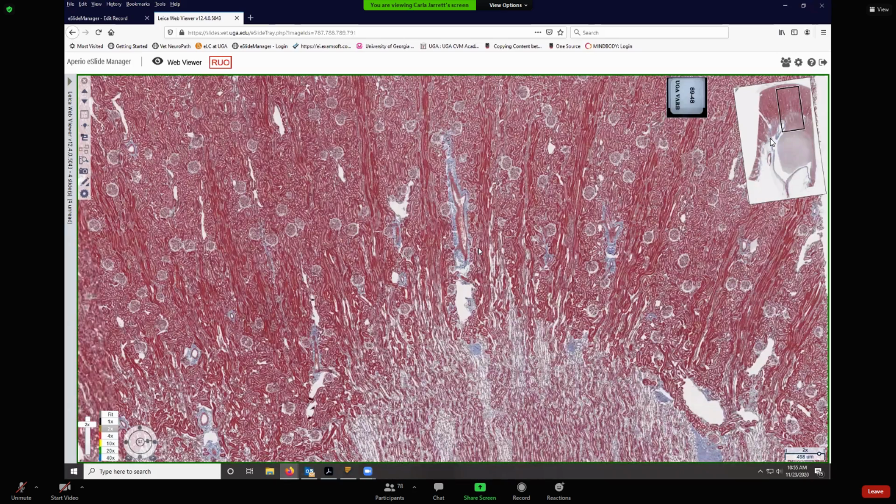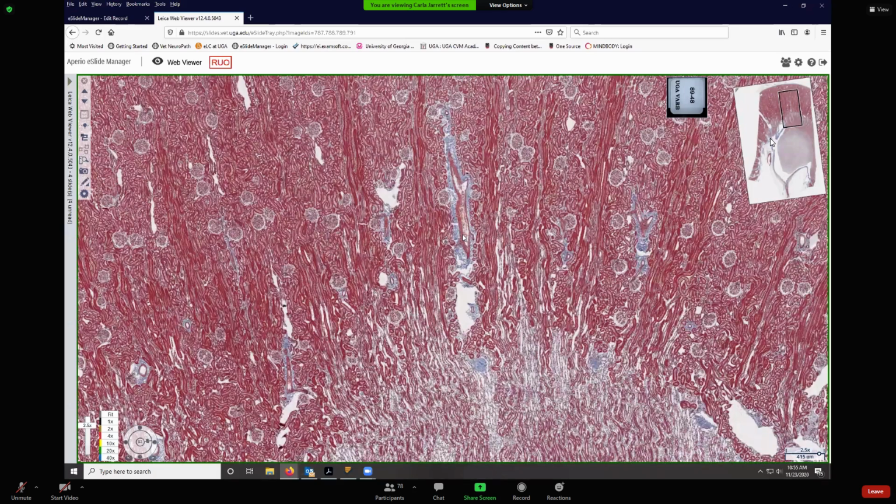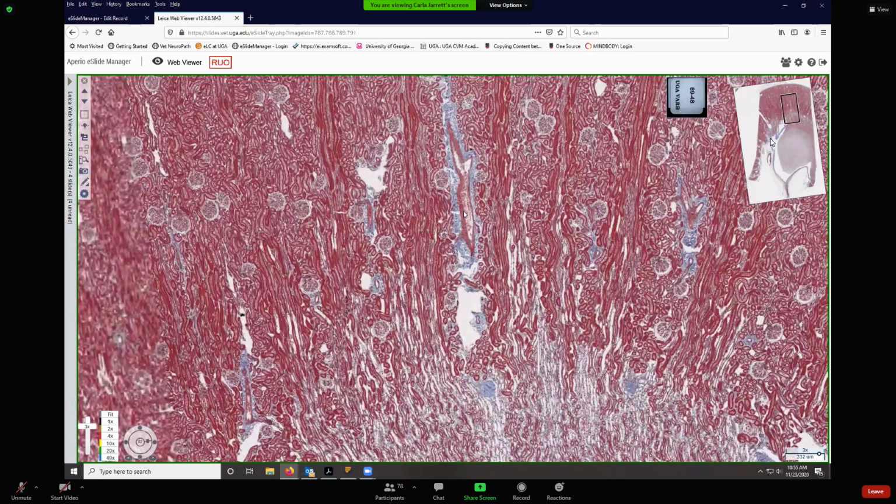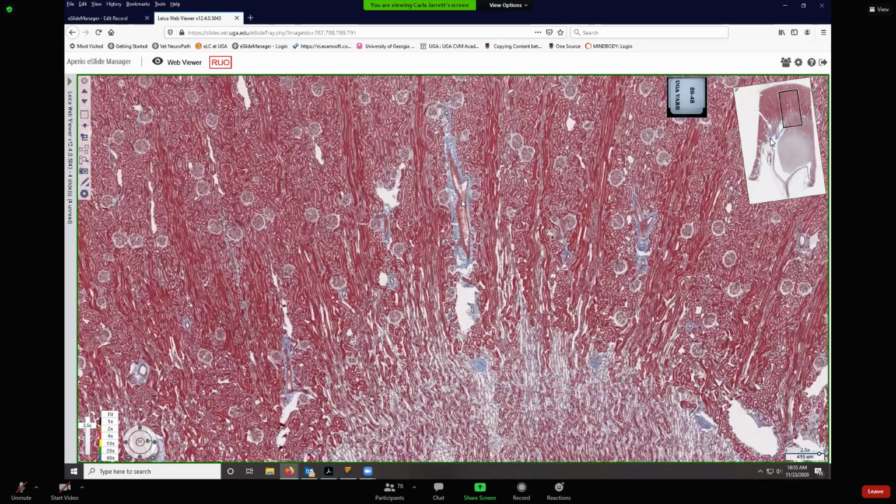Now, if you can ID an interlobular artery, that's also testing your knowledge of, do you know what a lobule is in a kidney? So a lobule is half of a cortical labyrinth with a central axis of a medullary ray, and then a half of a cortical labyrinth on the other side of that medullary ray. So these interlobular vessels, here's an interlobular artery, and here's an interlobular vein, they mark the boundaries of that lobule. So this is one kidney lobule right here. So one of these interlobular arteries right here were being indicated, and you were asked to ID that vessel.